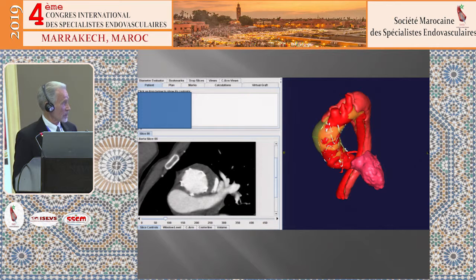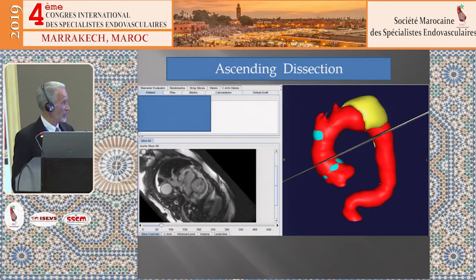This patient, this is a 1-year follow-up on that same patient. So here's the endograft. He's nearly healed the ascending aorta. These folks still have the descending component, but those can be treated with other methods that are currently under development.